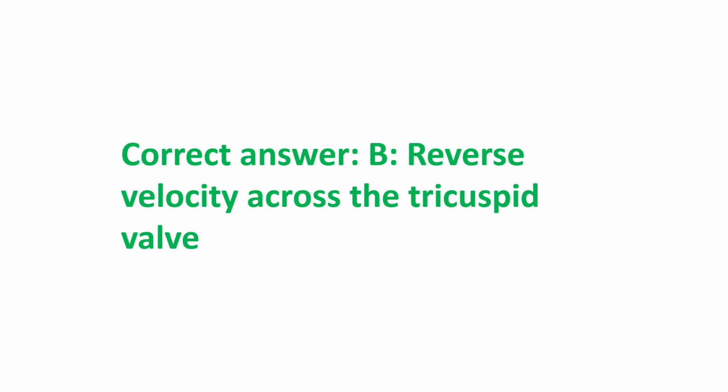If a nominal right atrial pressure of 10 millimeters of mercury is added to it, right ventricular pressure and indirectly the pulmonary artery systolic pressure are obtained in the absence of pulmonary stenosis. If there is high right atrial pressure with elevated jugular venous pressure, 15 or 20 millimeters of mercury may have to be added instead of 10 millimeters of mercury.